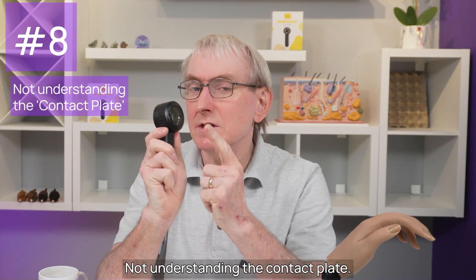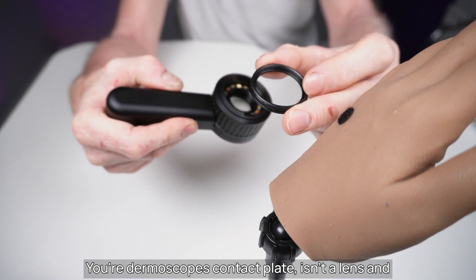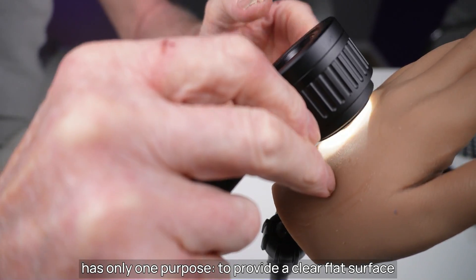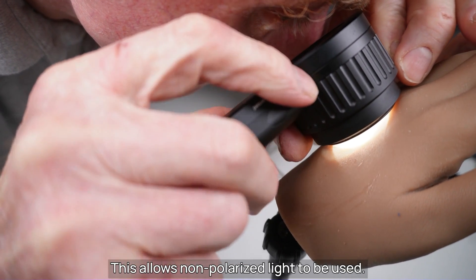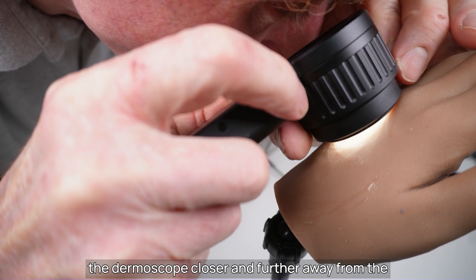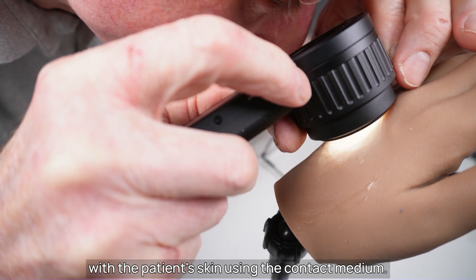Mistake number eight: not understanding the contact plate. Look at the contact plate in this Ibulu DE3100. Your dermoscope's contact plate isn't a lens and has only one purpose: to provide a clear flat surface to sandwich a contact medium between it and the patient's skin when performing contact dermoscopy. This allows non-polarised light to be used. This dial has only one function — to move the lens of the dermoscope closer and further away from the skin to enable you to focus, while maintaining contact with the patient's skin using the contact medium.